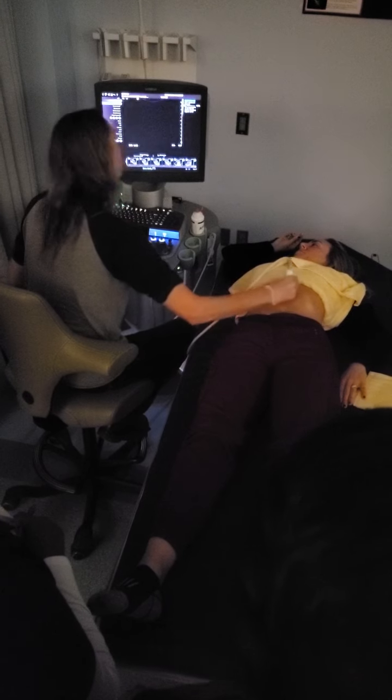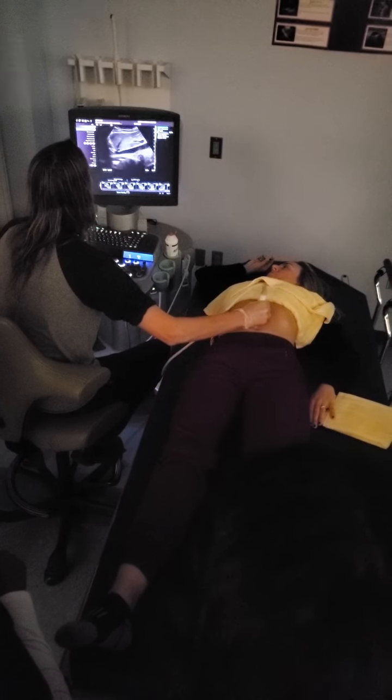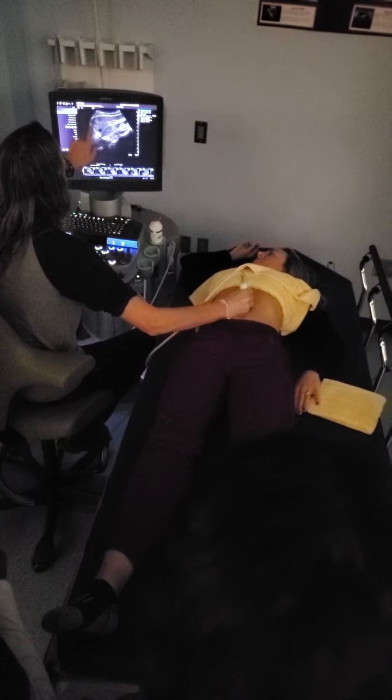So for the sagittal liver lobe measurement, go ahead, breathe in. It's just exactly midline. So in this case, it's such a large liver. I'm midline on my patient, and I have to know where this end is. You kind of follow it with your finger. Well, use your brains. And out in the real world, you have what we call wide scan, where you can actually widen this. The Philips has it. I think the GE has it.